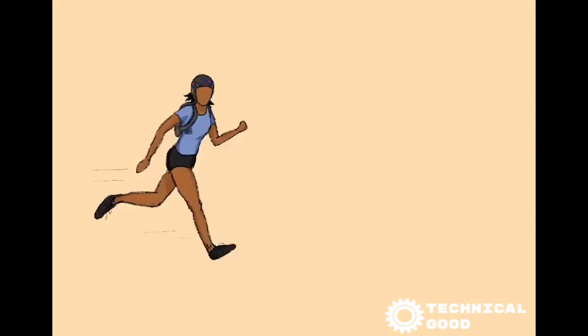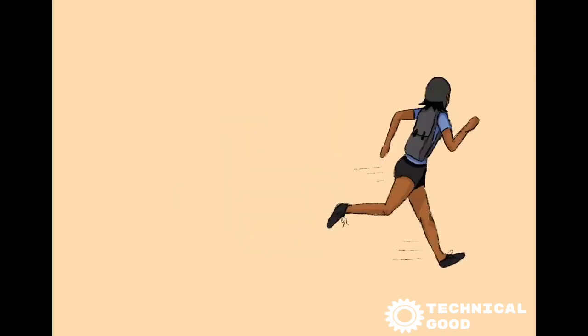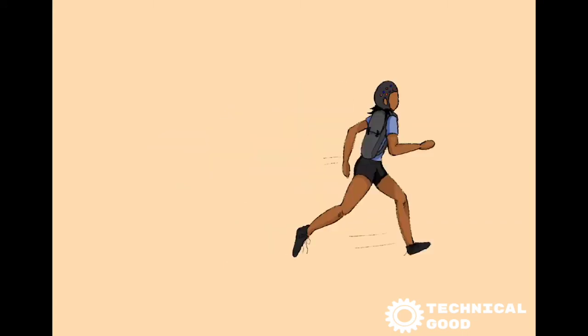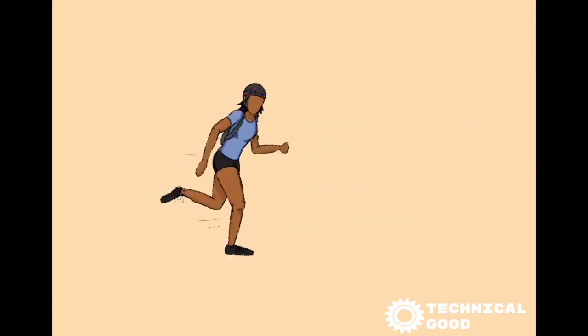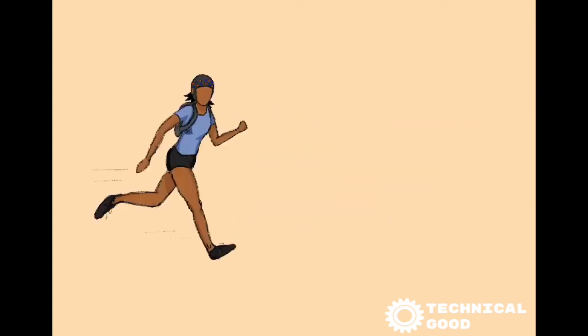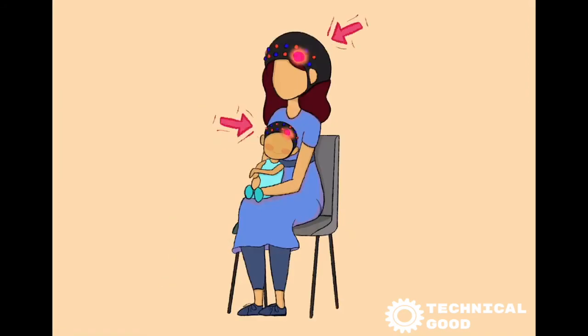The good thing about this technique is that some devices can handle movements quite well. There are also small devices that you can carry around with you in a backpack while it is recording. This makes it possible to look at your brain when you are running or when you are at school. You could even see what happens in the brains of two people at the same time. fNIRS is not harmful and is very safe. This makes fNIRS also suitable for very young children and even babies.